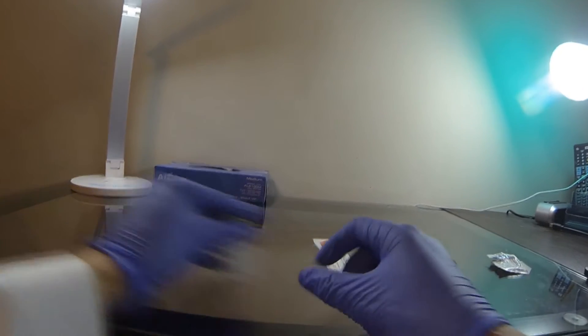First, pull off the cap of the solution bottle. Next, wipe the top with an alcohol swab. While waiting for this to air dry, take apart your syringe cap.